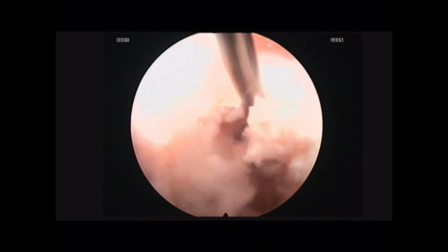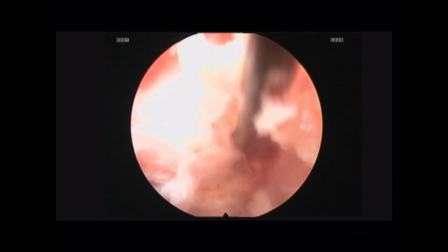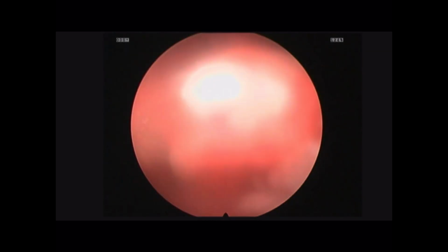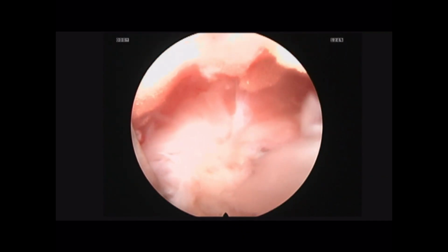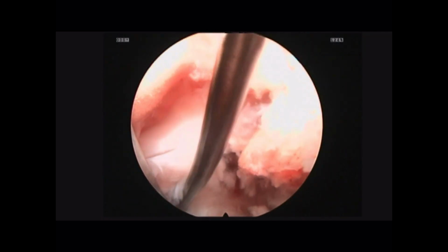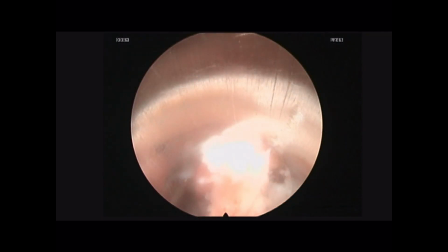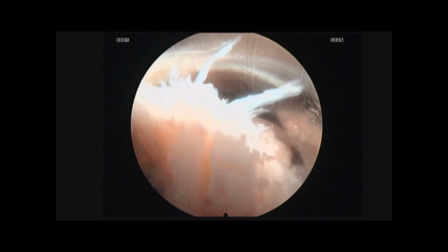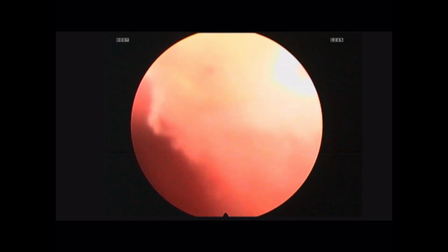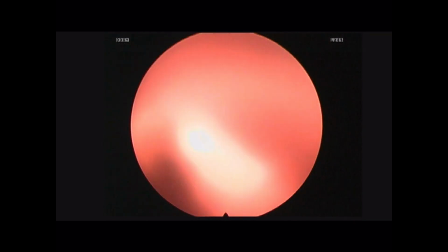You can see that throughout this video, and it does a good job of showcasing that you do not need to always rely on your graspers and can get a good discectomy performed by utilizing all the tools available to you. Here we are following a large disc fragment as it is irrigated out of the beveled cannula. You can see some of the larger pieces being pulled away, utilizing the endoscopic graspers here.